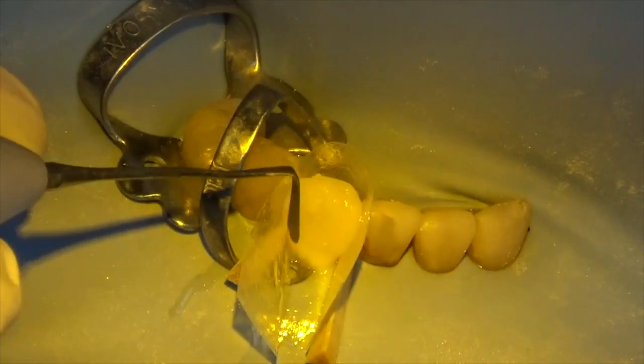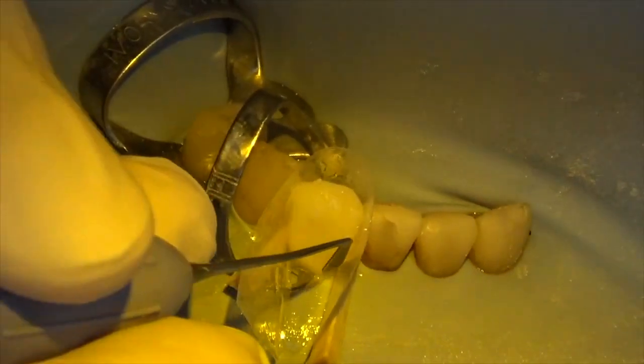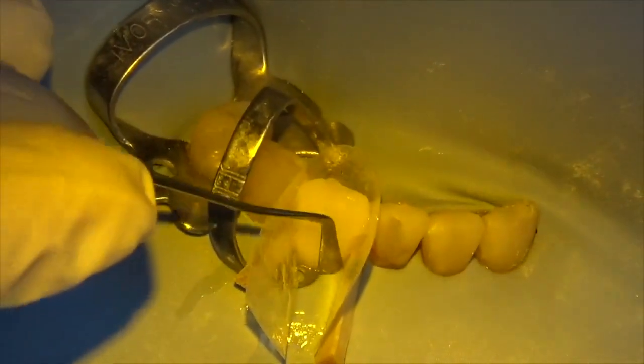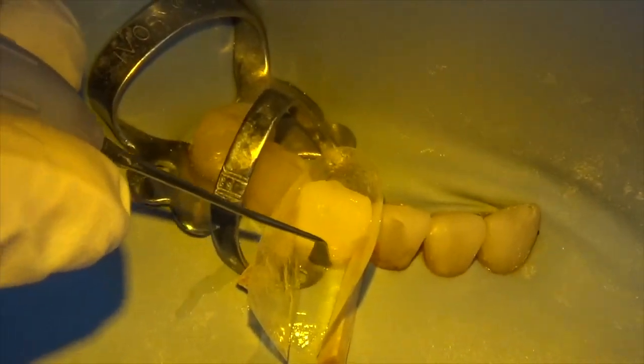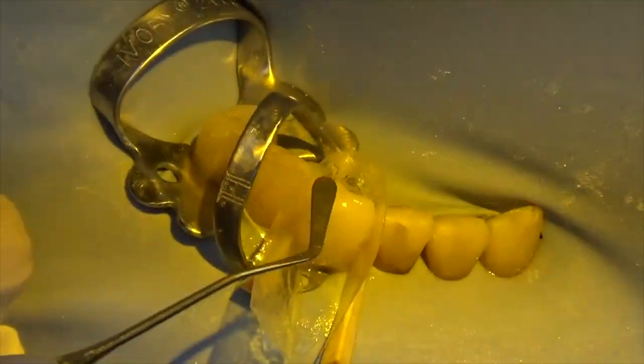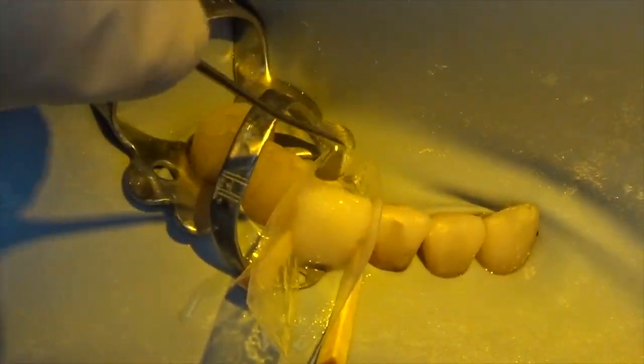You'll notice I was able to basically do a monolithic restoration — doing all of the composite in a single piece. Everywhere you have joins in composite resin, you have a risk of stains, so we really want a seamless restoration. There's no point doing multiple layers on a case like this.